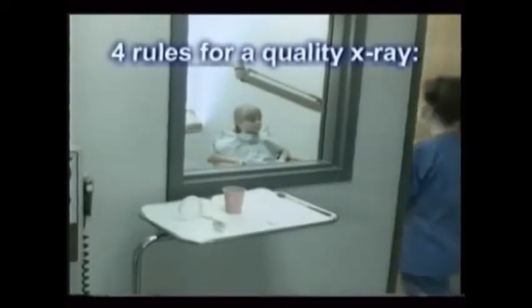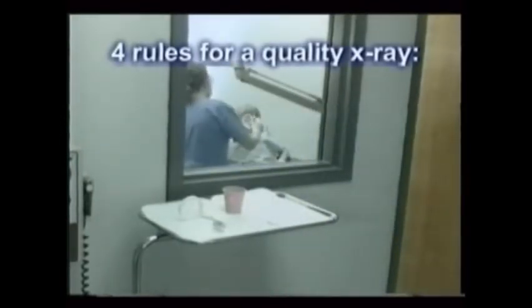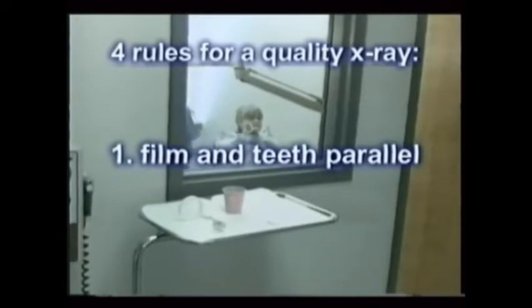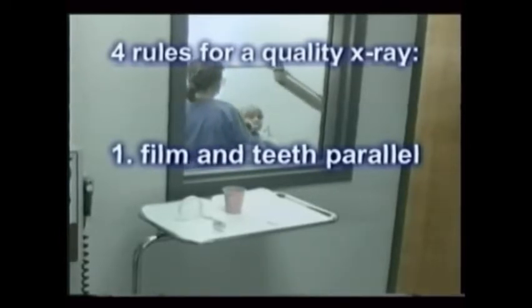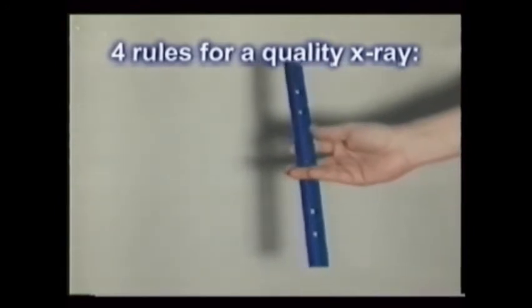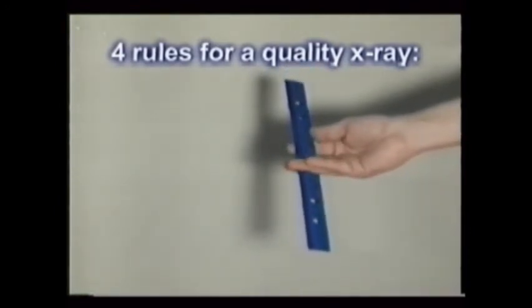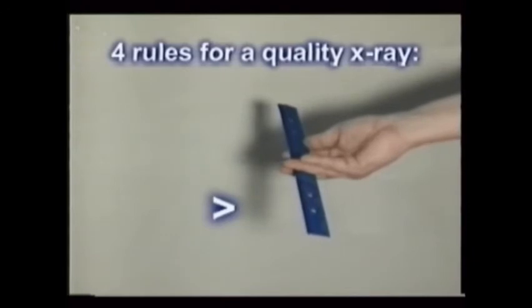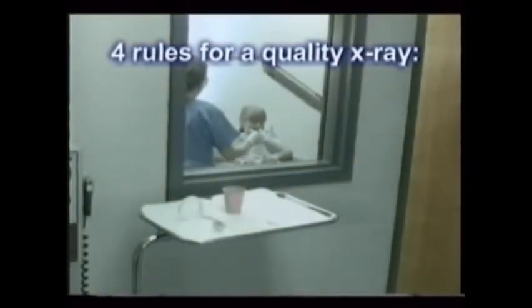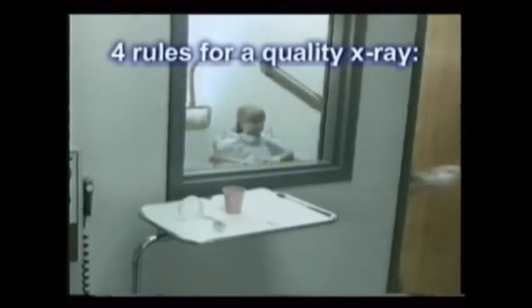There are 4 basic rules in capturing an X-ray image of the teeth on the film. These rules cannot be repeated too many times. First, the film and the teeth should be as parallel as possible in both planes. This is never absolute, just a goal. The portion of a film further away from the teeth means that a blurrier and slightly enlarged image will appear. In both planes, horizontal and vertical, try to keep the film in line with the teeth.